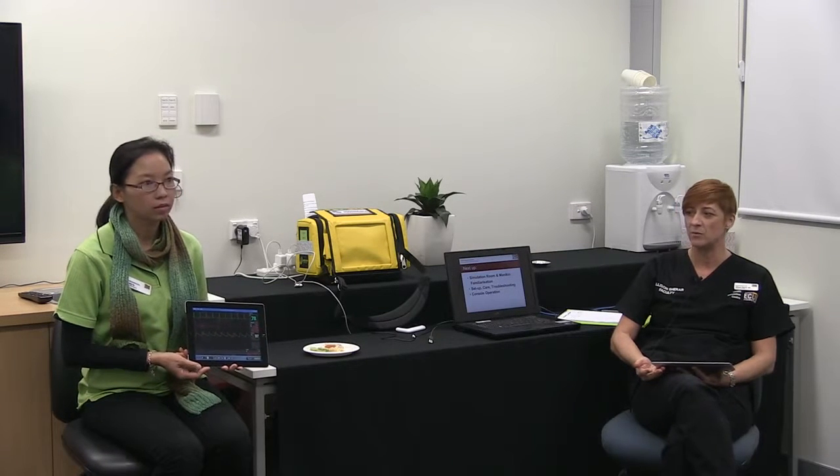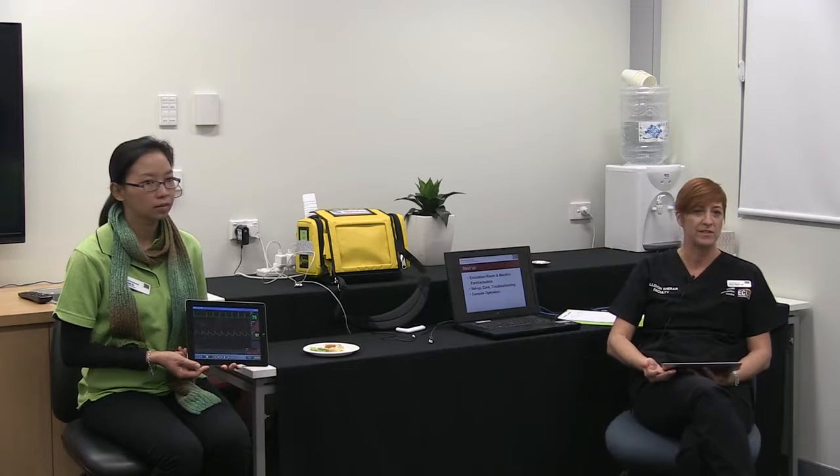We can bring up a SATS monitor there. You can use this with your mannequin if you needed to take it somewhere — in a lift, for example — or you can use it with what we call a simulated patient, which is essentially a well person playing the simulated role of a patient. So it's great for those behavioural things, especially behavioural pain management.